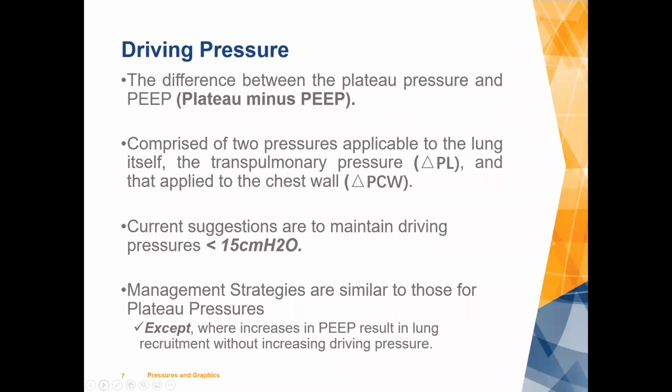So your driving pressure. This is one of the pressures that over the past decade or so we know is also implicated in ventilator-induced lung injury. It's the difference between your plateau and your PEEP. So there again, the plateau comes into play. Think about the term driving pressure: your baseline is the PEEP, and the driving pressure is the pressure to drive that breath in, but not including the resistive component.